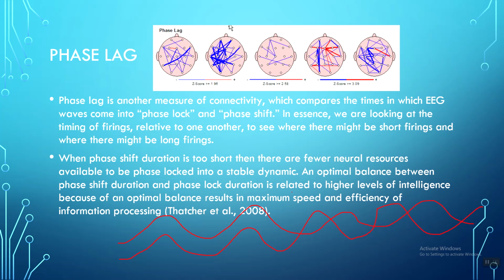And so I like to think of phase lock when it's deviant, when it's too locked, right? It's almost like a dictatorship, where everybody has to wear gray, if you think about like North Korea or something. And everybody has to behave in a certain way. And so that's too much phase synchronization. Neurons don't get to break away and call on other people to do the same thing. Phase shift is like anarchy, right? It's like nobody's cohering whatsoever. It's a very similar thing to coherence, right? Now, when you have too much phase lock, you don't have enough phase lag.